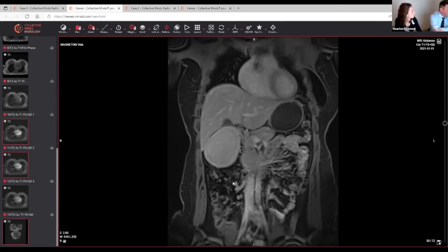So to give also an answer to the question before, I think we will in the future guide our biopsy more in the regions which are suspicious, yes. And that will not be a region of necrosis or hematoma or cystic parts, but really a region which is heterogeneous without a typical pattern.